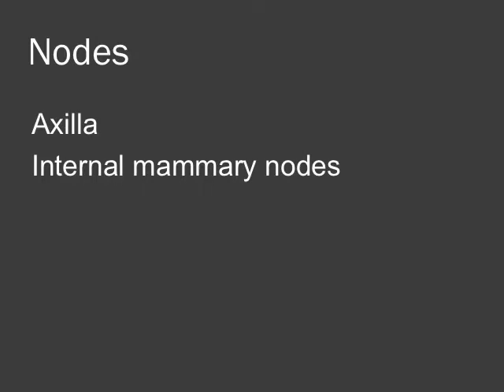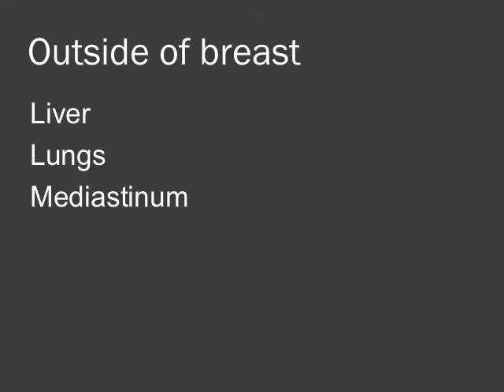We want to check the lymph nodes — both in the axilla and in the internal mammary area. Although axillary lymph nodes can be quite large, we're going to be looking more at the morphological characteristics. We usually do not see internal mammary nodes larger than about five millimeters, so any internal mammary nodes should raise concern. Make sure you look outside of the breast before you finish: look at the liver, the lungs, check the mediastinum. We pick up a lot of incidental findings — sometimes just liver cysts, but also hemangiomas, metastases, and other lesions.